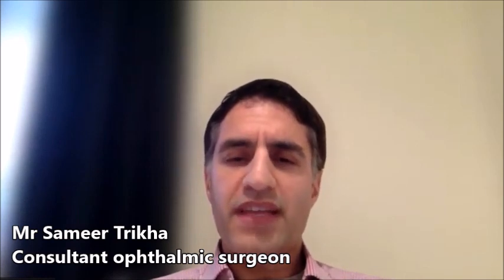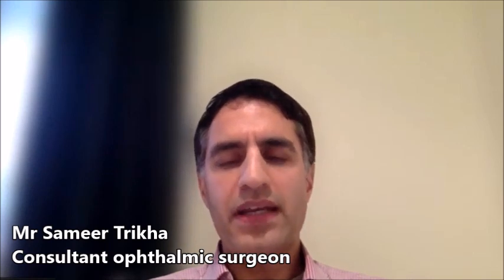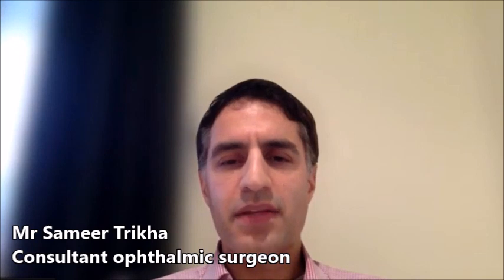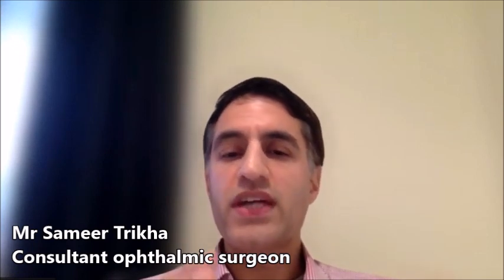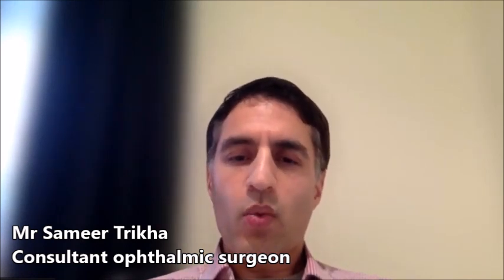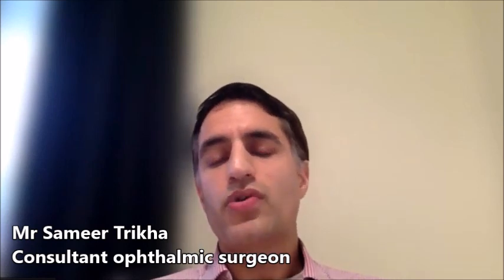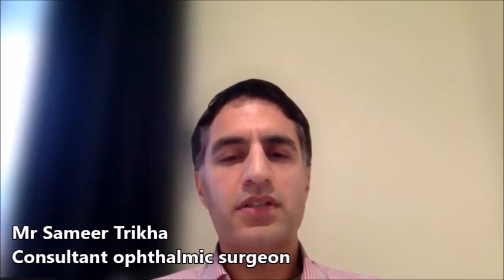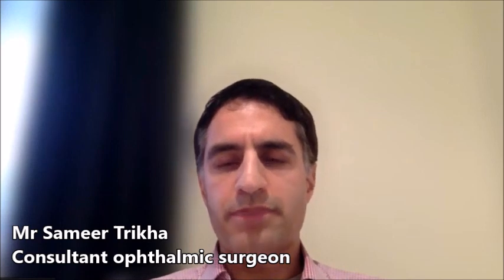Now, the third group of lenses is a type of lens known as the multifocal lens, which inherently does cause a slight reduction in the amount of light transmission and something that we call contrast sensitivity. And that's the ability to differentiate between shades of color, for example. Now, in patients with glaucoma, one of the symptoms of glaucoma is an actual loss in contrast sensitivity as well. And therefore, I don't usually recommend multifocal lenses in patients with moderate or severe glaucoma.